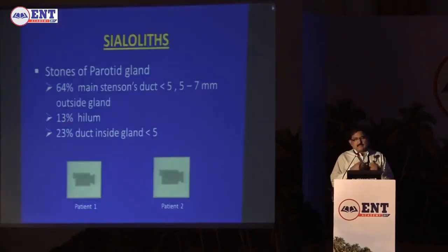Now this grasping a peanut from the bronchus, you know, you have to hold the peanut, and in a pediatric bronchoscope you pull the peanut through the scope, what happens? The peanut is going to fall down. So the teaching is you hold it nicely and take it out as a unit. The same teaching in salivary endoscopy also.